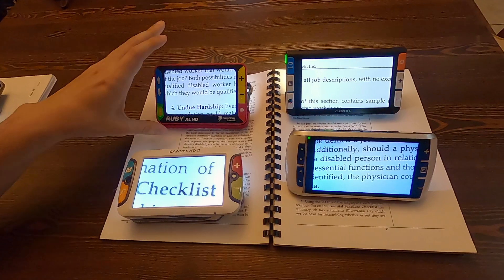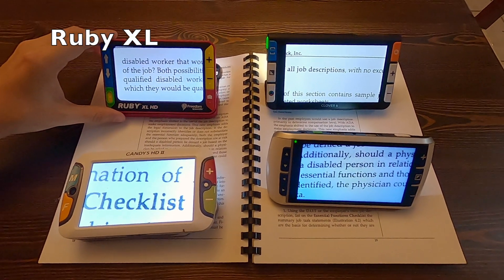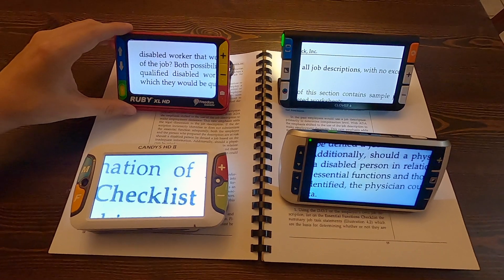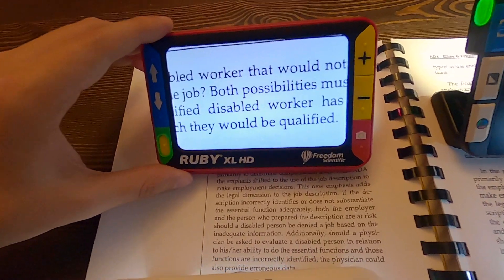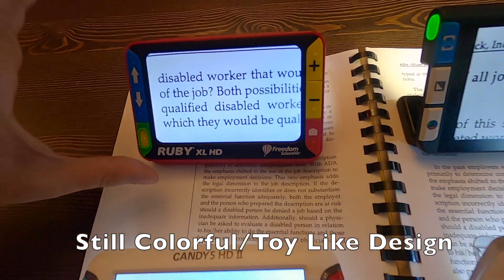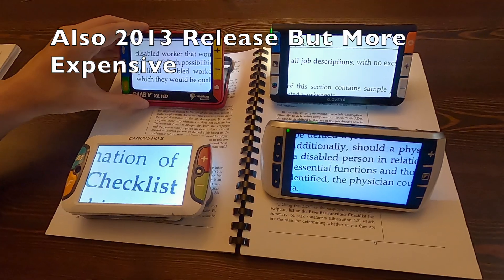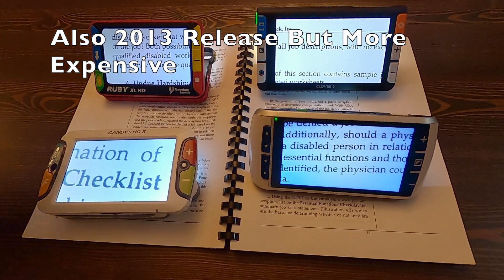Then we get into the Ruby, and you can see this is where we start getting more of the modern day crisp image we're used to. But it's still got the colorful childish buttons and it is cartoony fire engine red.